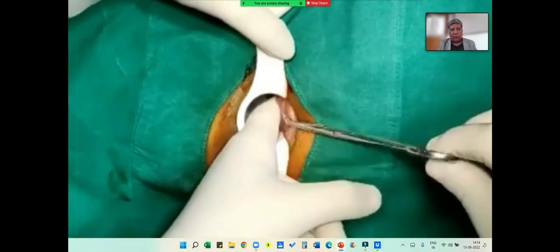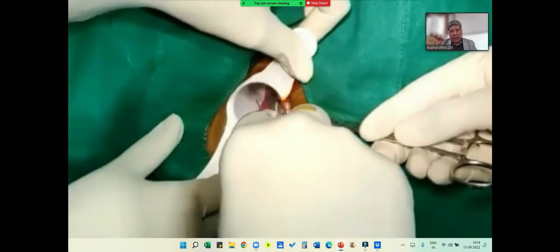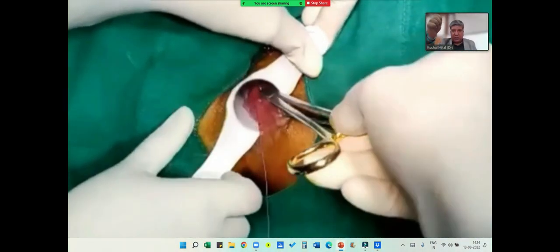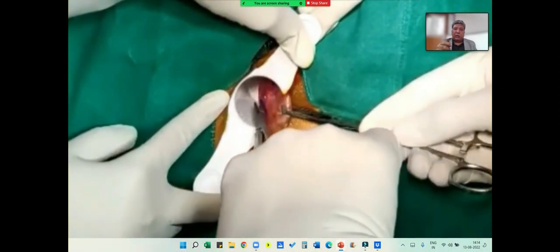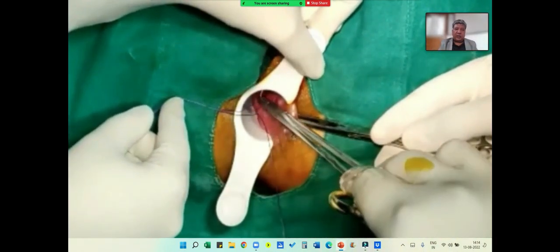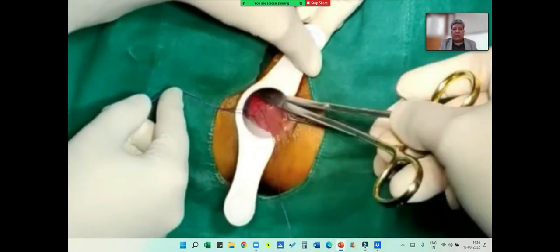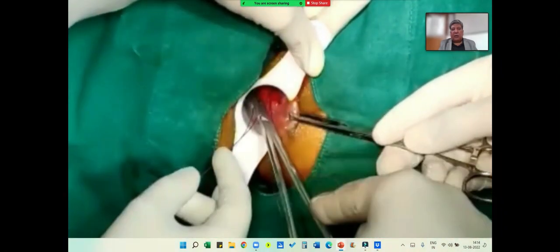So, this is just a short film to show you. That's palpation by finger, then taking the stitch. And remember, pronation and supination should be complete with your hand. Once you take the needle out, then you lift the thread so that you can go under it again. So this is the second bite. Once it goes in again, now this is the time you can milk it and tie it.